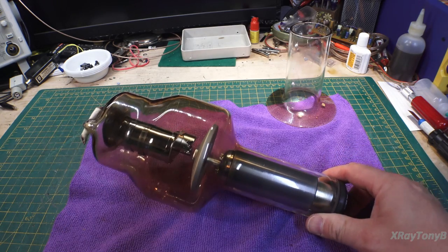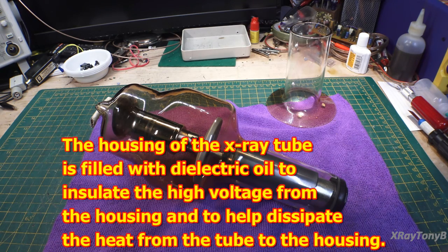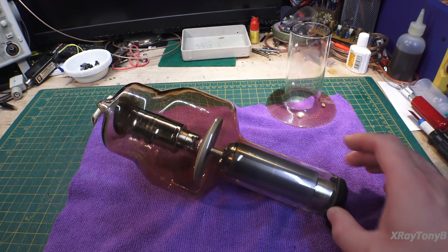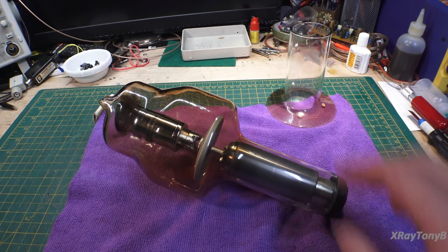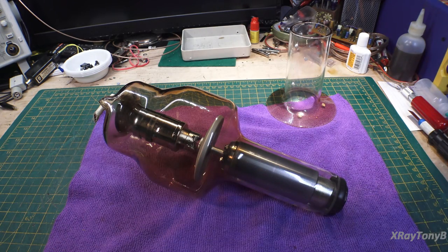So what this is, is a modern x-ray tube, and it's sitting here on this little towel because it still has oil on it. If you go way, way back in my videos, I did a video on an x-ray tube already, and that one was still in the full housing. This is the actual x-ray tube, but in our profession we call this the insert. It's actually the vacuum tube itself, and we call the x-ray tube the whole assembly, which would be the housing that this is mounted in, and the stator and all those things, all one piece. That's the tube. This is the insert. So it's just a terminology thing that we use.